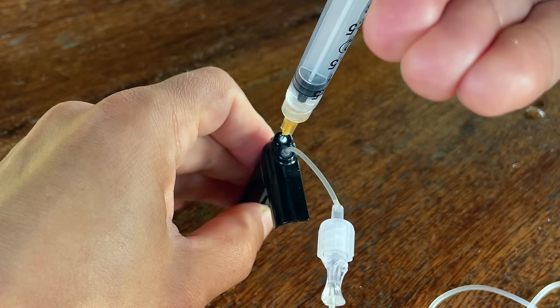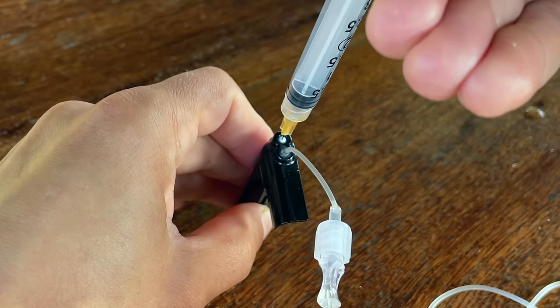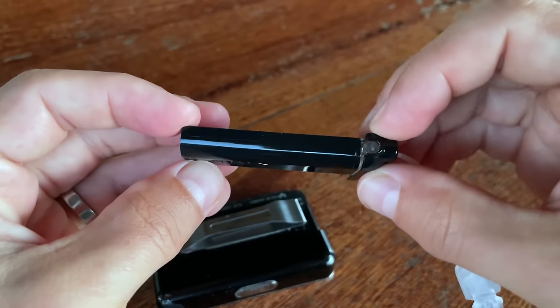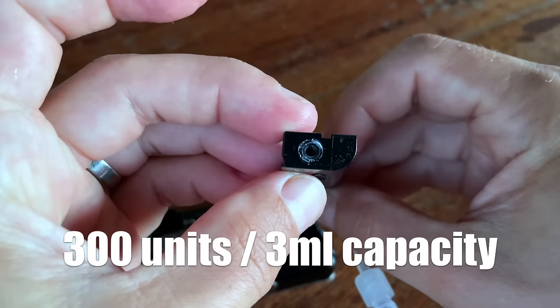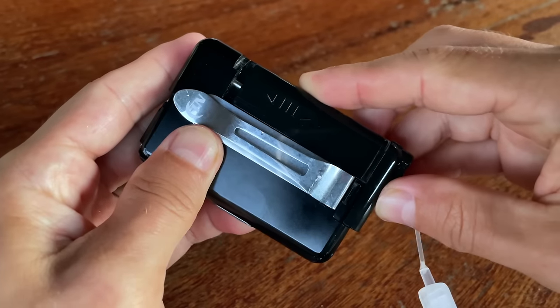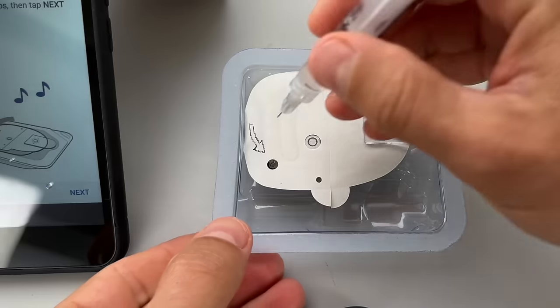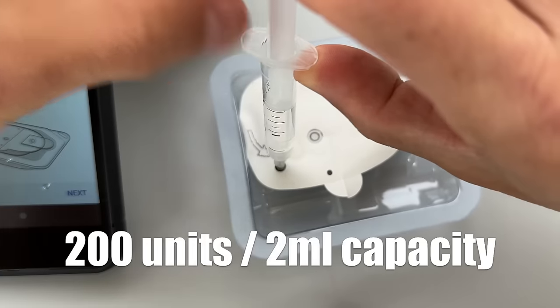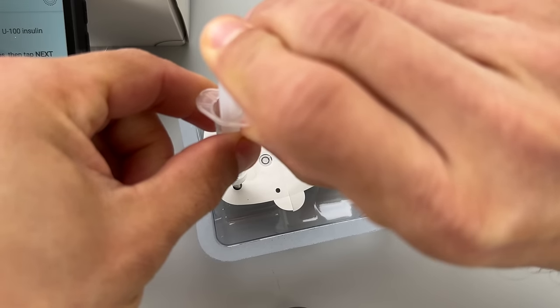Another difference is the reservoir size. T-Slim stores insulin in a bladder system with a capacity of 300 units and a minimum fill of 50 units. The Omnipod 5 reservoir holds 200 units with a minimum fill of 85 units. So if you need a lot of insulin or very little insulin, T-Slim might be a better option for you.